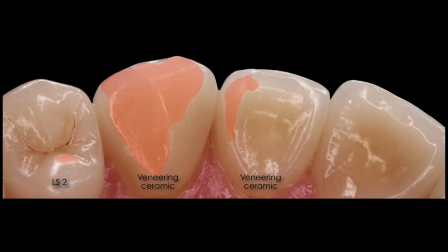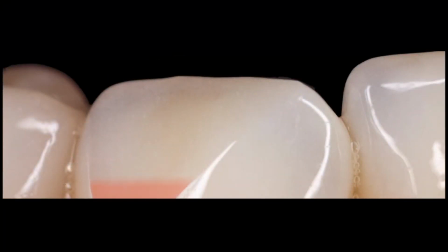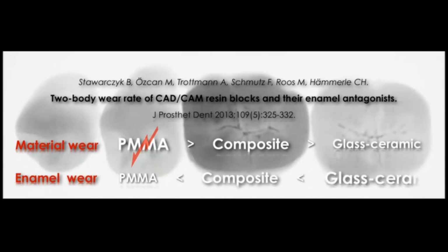I mean that you have your own patterns in this dentition. This material shows you that it's capable of doing that. And again, this was a lower canine, and this was made with e.max Ceram veneering material, and we have observed a lot of wear and wear facets in these patients.